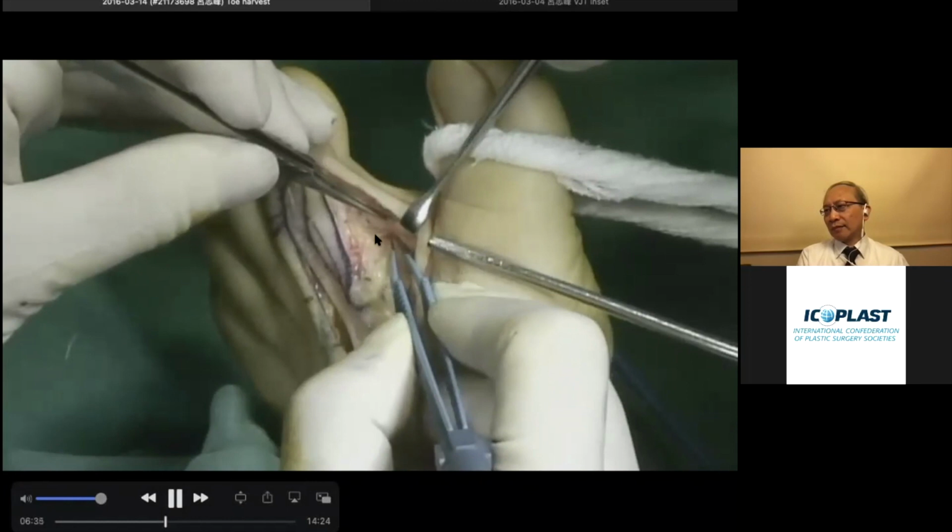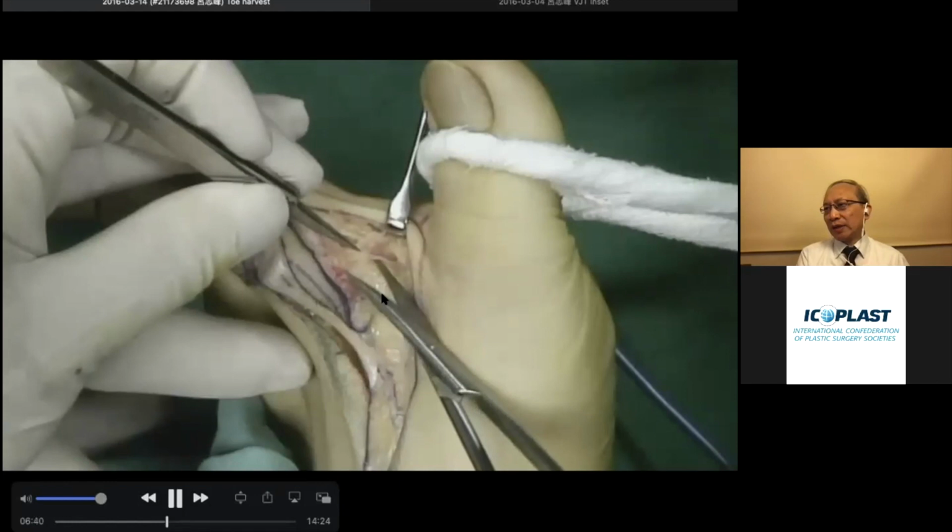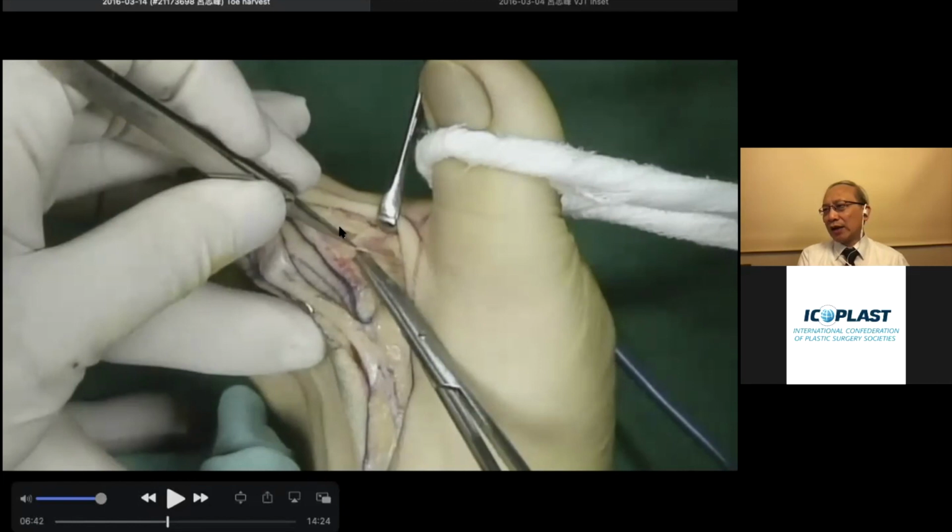Sometimes the plantar digital nerve goes too close to the digital artery, and it is very difficult to dissect between the nerve and the artery at the PIP joint level. You can start from the trifurcation area, around the MTP joint area, where the nerve goes a little bit farther away from the plantar digital artery. Then you can start from here and go distally to dissect the nerve away from the artery, preserving the nerve to the toe.